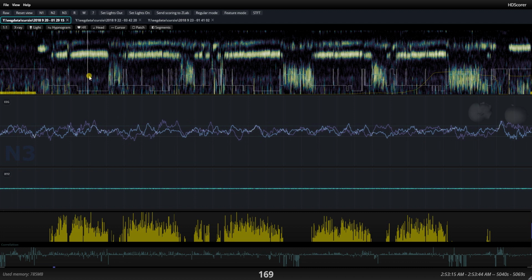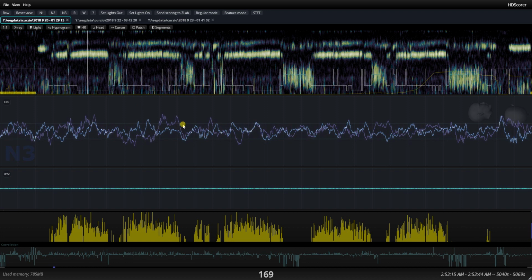The AASM rules for determining N3 sleep are based on voltage, amplitude, and time. There's a requirement for the delta waves to exceed the plus minus 75 microvolts level, which is marked here with these two horizontal lines, for at least 20% of the epoch. This kind of guideline is underspecified. That is, you cannot translate it into an algorithm. Let me give you some examples.